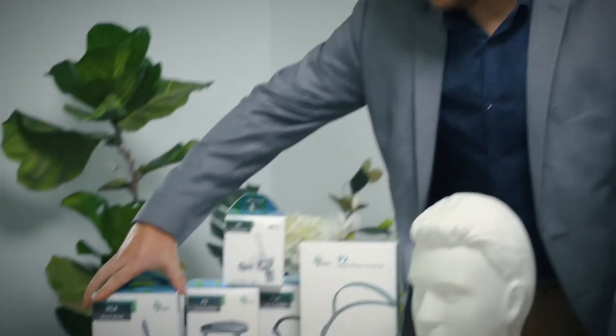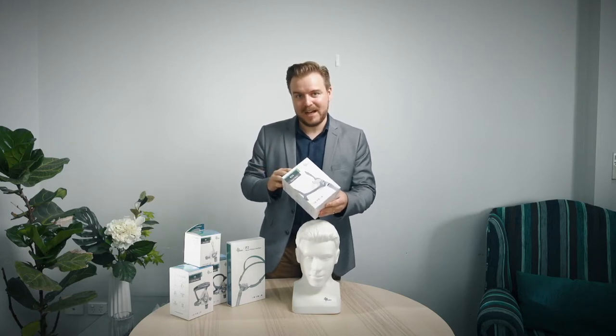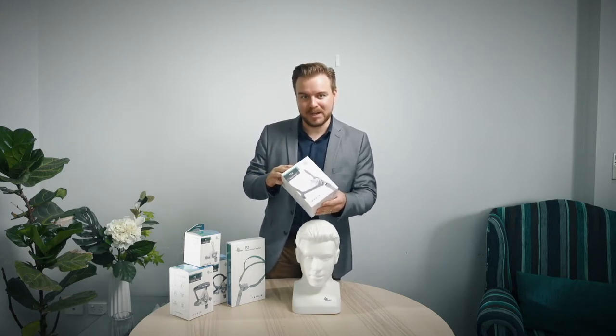Hi, I'm Lachlan from B Medical. Today I'm going to be demonstrating a number of BMC products — care on the products, some features of them — just to give you an overall understanding of how the BMC products operate. In this video I'm going to be demonstrating the unboxing of the BMC N5A nasal mask. I'm going to go through some tips and tricks and let you know why you should choose this mask.